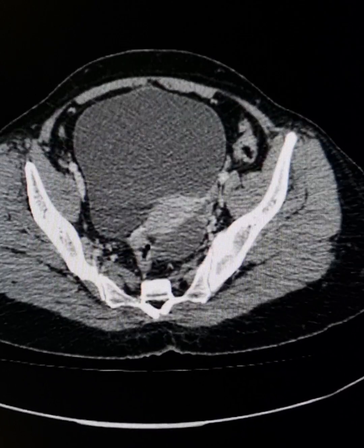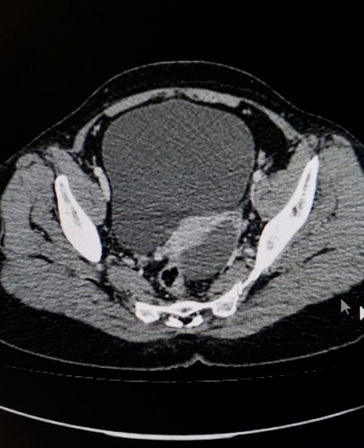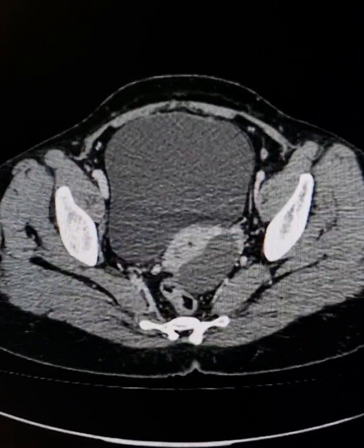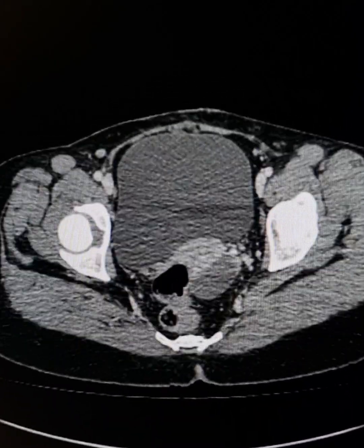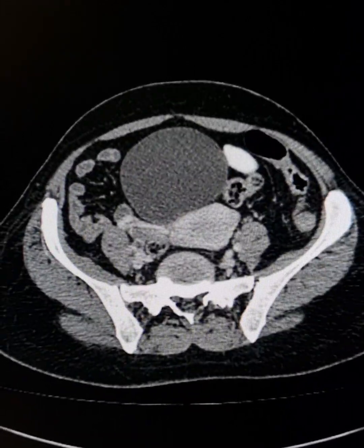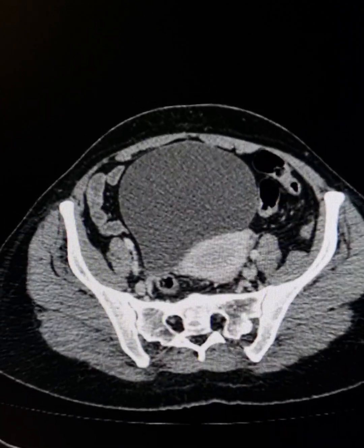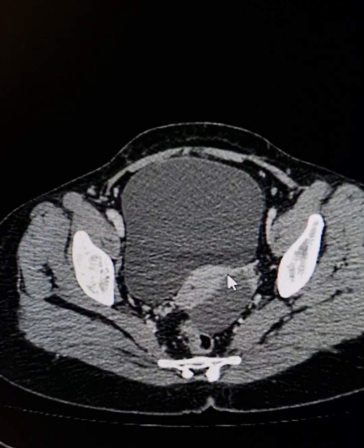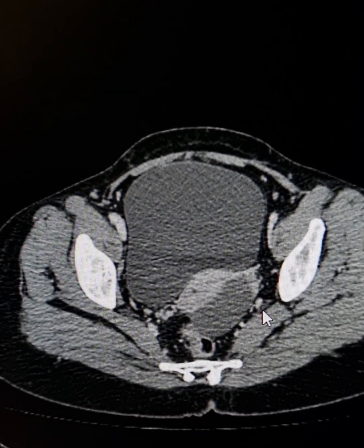If there is a previous history of surgery and both the ovaries are visible separately, for example, in this particular case we cannot make out the left ovary, but in post-operative cases the ovaries are separately visible, the uterus as well, but there is a history of previous surgery, for example either cesarean or hysterectomy, and you find both ovaries, but there is a cyst which doesn't contain a wall, but that is not this well defined. Now this is an ovoid, that means it has its integrity.